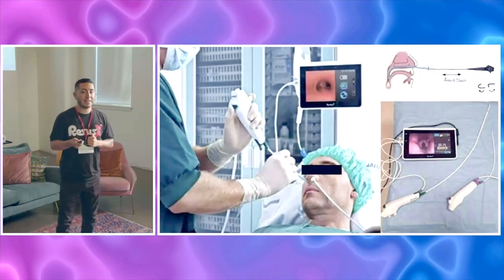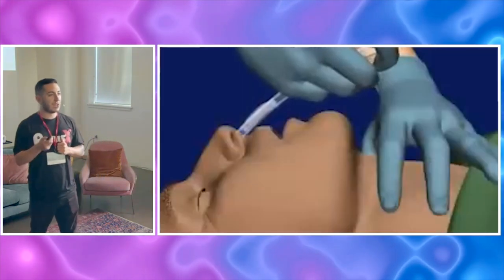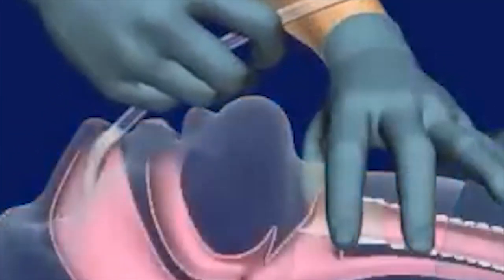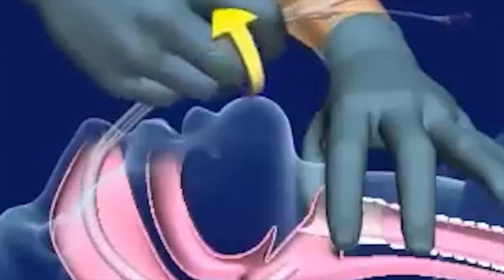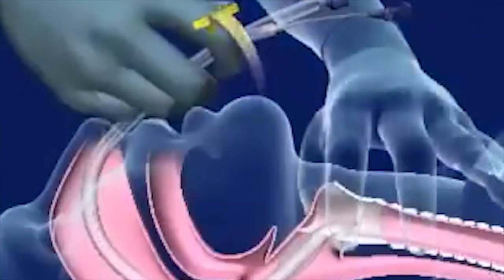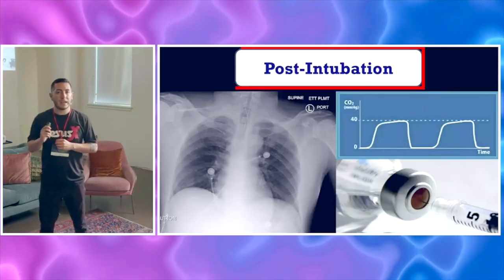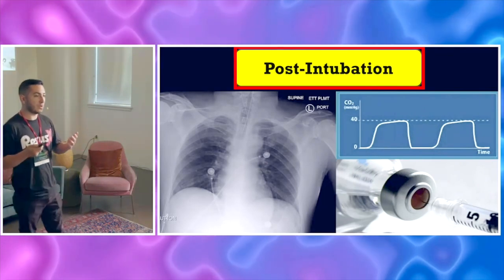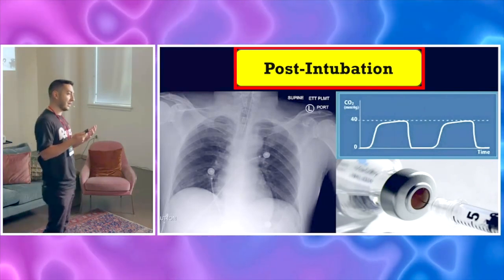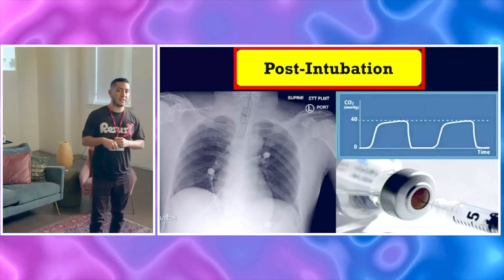If you're performing nasal intubation, I recommend that you use a fiberoptic scope. You should not be doing this blindly unless you really don't have a scope available. And like Haney said, we'll have a workshop later this morning as well as this afternoon where you guys will get a chance to practice with the scopes. And then finally, once you've intubated the patient, make sure that you put them on end tidal to confirm placement, get an x-ray to confirm that it's in the appropriate position, and then provide analgesia as needed.